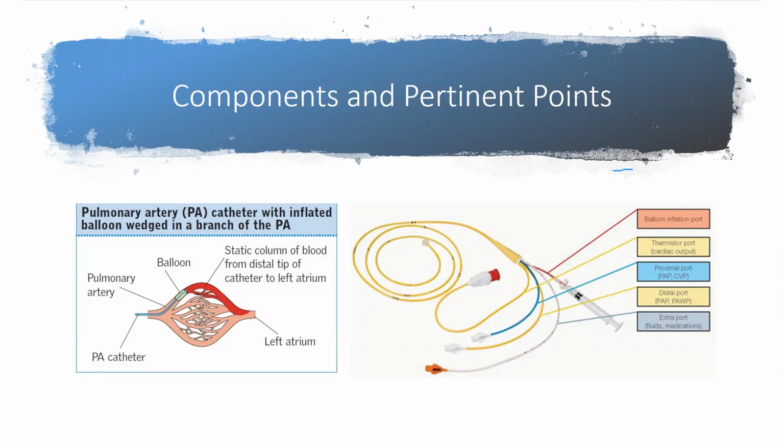All right, the pulmonary, the other thing that we're going to have is, why do I have this particular slide? The reason why I have this particular slide is to drive the point that when you inflate the balloon right here, what you're going to be measuring is the pressures of the left atrium and thus the left ventricle. So whenever you wedge this balloon or inflate this balloon, occluding it, you're measuring left-sided pressures.